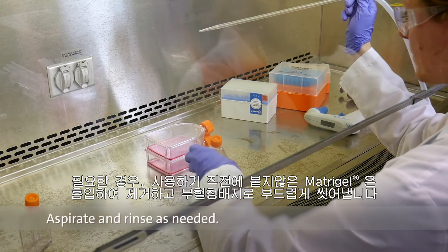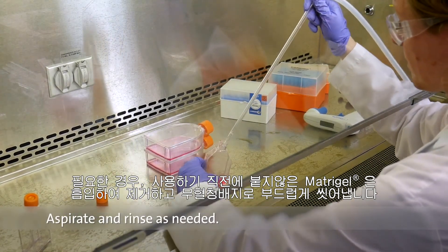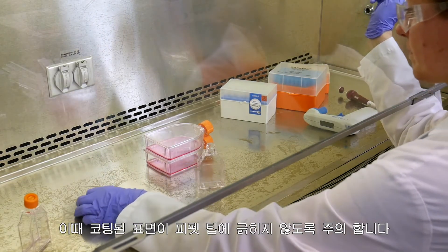If necessary, aspirate unbound material just before use and rinse gently using serum-free medium. Ensure that the tip of the pipette does not scratch the coated surface.